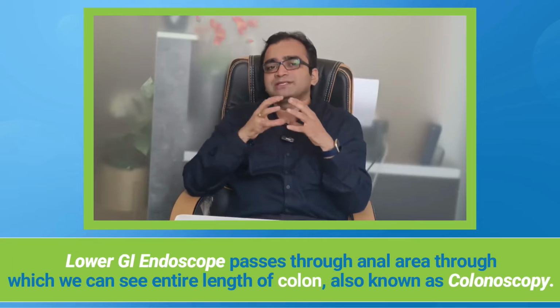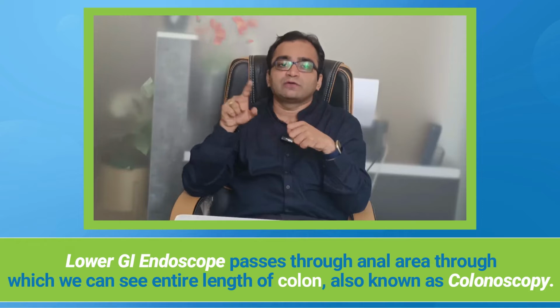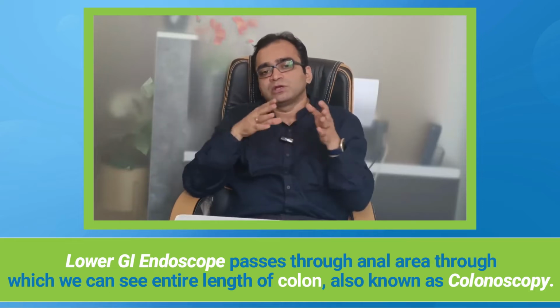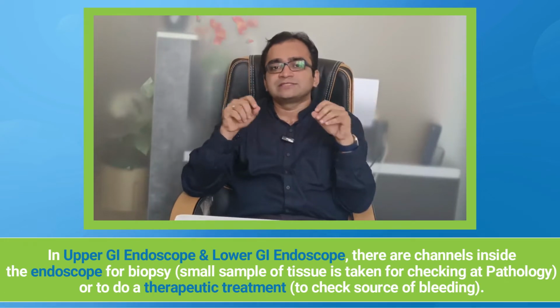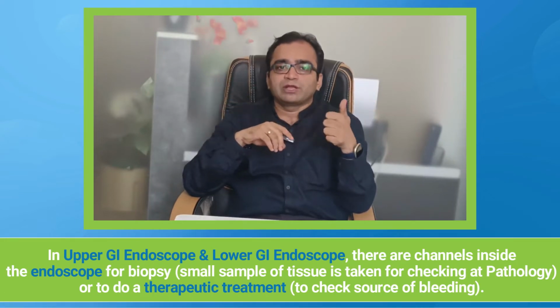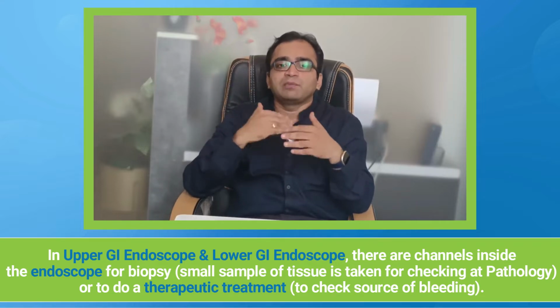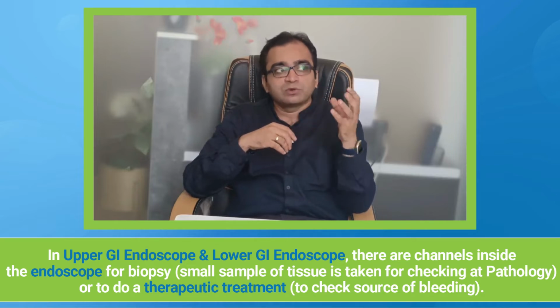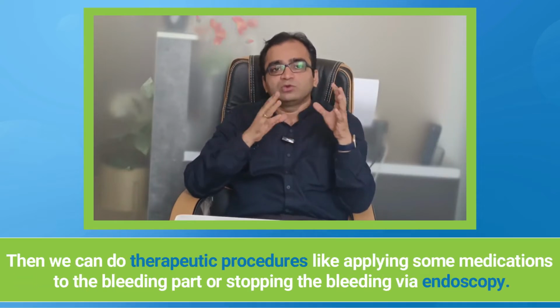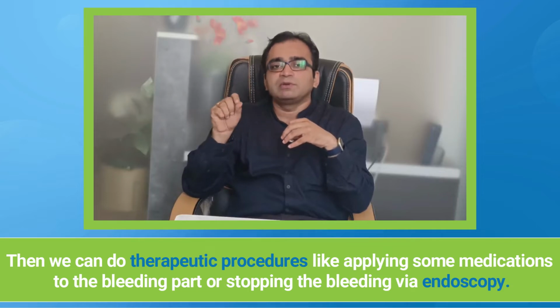And we have a lower GI endoscope which is passed through the anal area and which can see the entire length of the colon, right from the anal area to the entire length of the colon, which is also called a colonoscopy. In upper GI as well as in lower GI, there are channels inside the endoscope. If we want to take a biopsy, that is a small sample for looking into the pathology, or if we want to do a therapeutic treatment, let us assume that somebody is bleeding from somewhere, and while we put in the endoscope we see the source of bleeding, then we can do therapeutic procedures like applying some medications to the bleeding part or stopping the bleeding via endoscope.